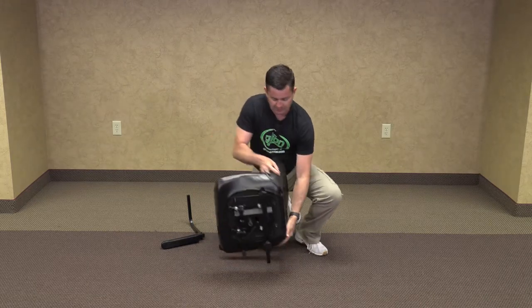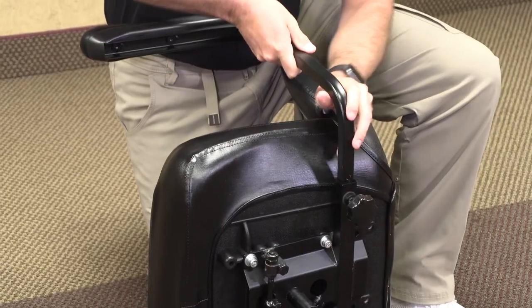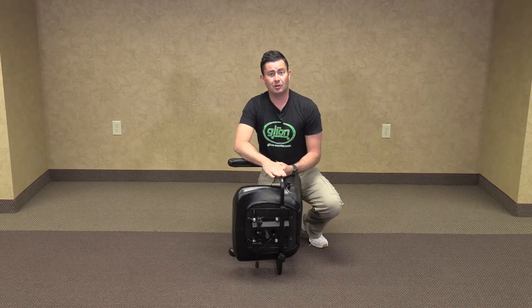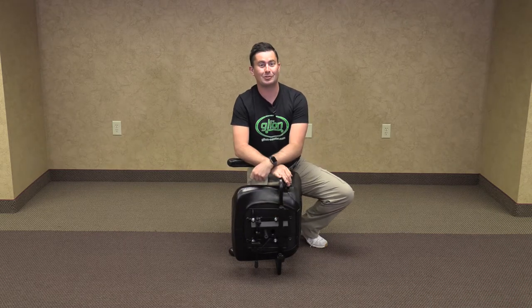Then we'll flip it over and install the other armrest, tightening the knob. These armrests are completely adjustable in width to whatever your specifications and comfort level are, but make sure to keep them secure and tight so that they don't fall out.